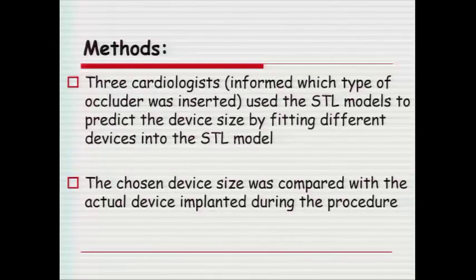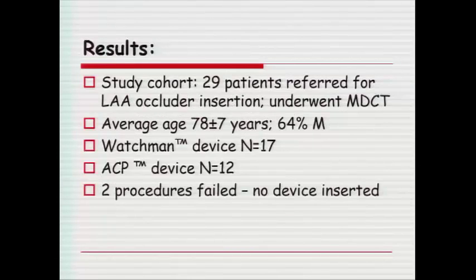Three cardiologists who were informed which type of occluder was inserted used the STL models to predict the device size by fitting different devices into the STL model. And the chosen device was compared with the actual device implanted during the procedure.